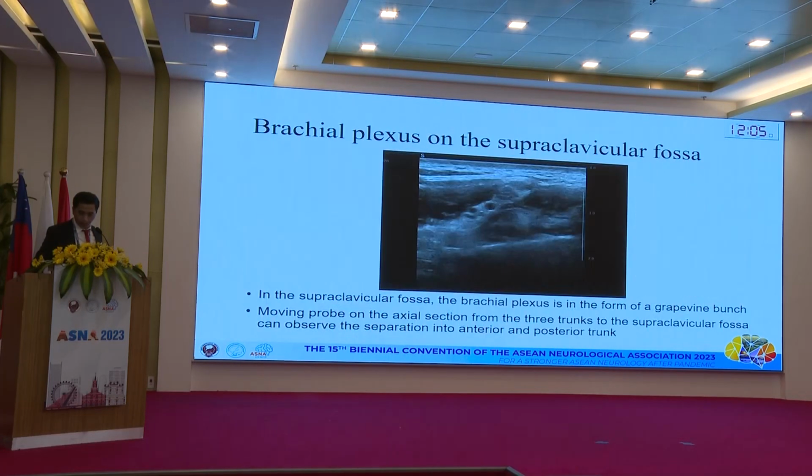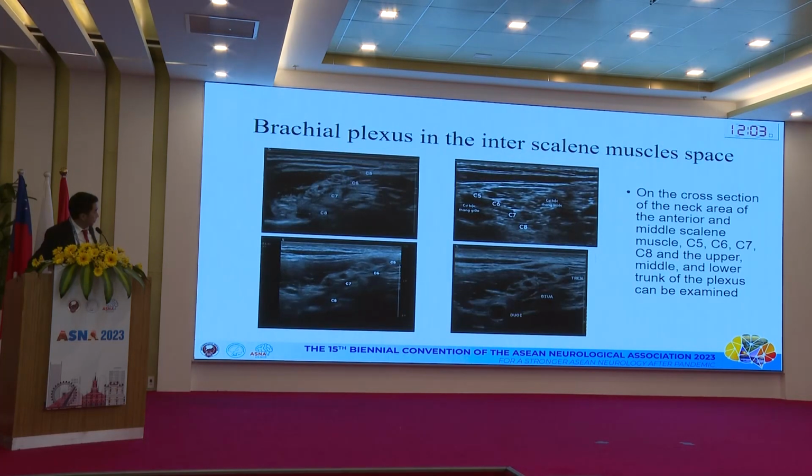I have a clip here. You can see we move down, and we see it connect. This is C5 and C6 becoming the upper trunk.